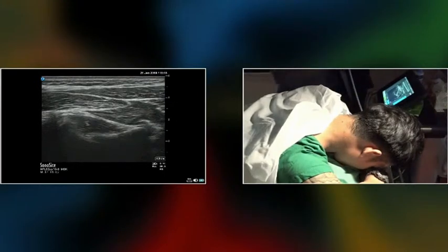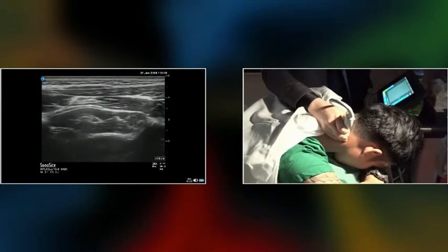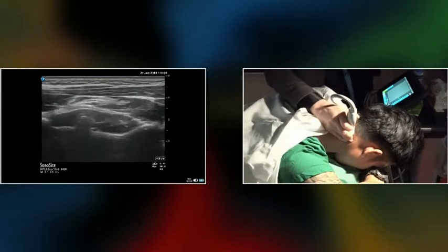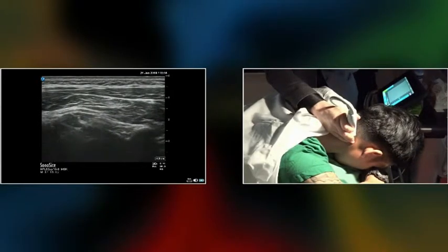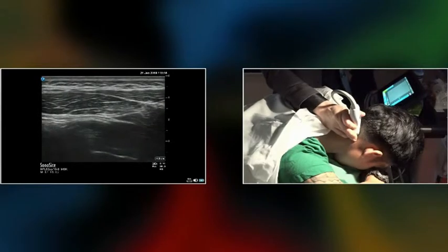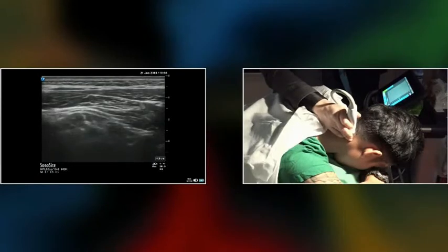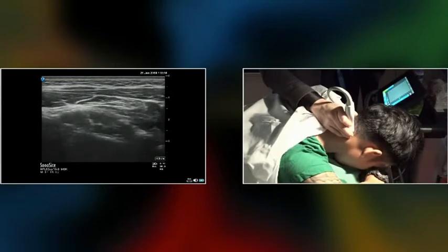So that's how we usually, apart from doing the nerve block, we also would like to ask the patient. You can see, if you scan down, actually it's the same muscles, isn't it? You see it. And then as you scan up, then you detect this kind of fascicles. This is normal. This is not a scar or anything. But if the patient's having some spasm or strings, you notice that this kind of regional contraction in the muscles will lead to irritation onto the nerve.